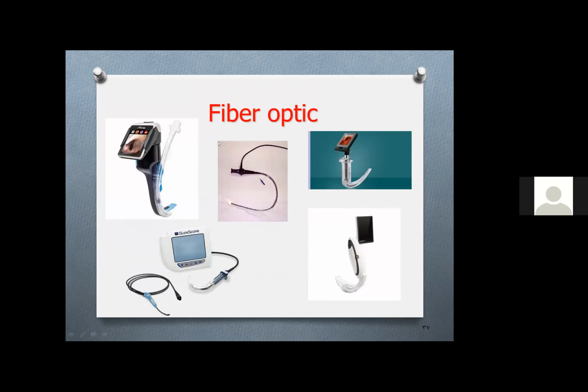For the fiber optic, there are a lot of devices available. This is the classic fiber optic. This is the C-MAC, the C-Guard, the GlideScope, and this is the one I like most, the AirTraq. We'll talk about it in a second.